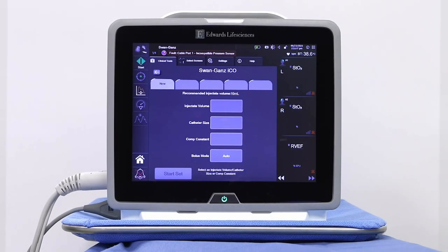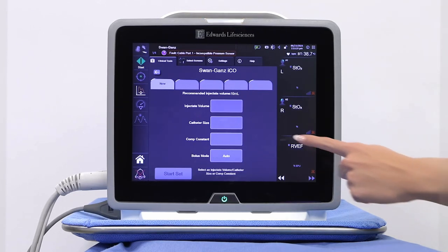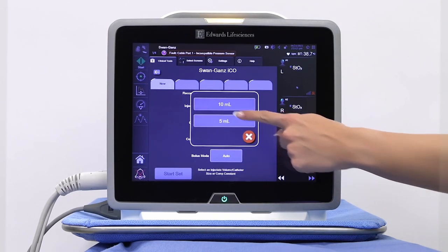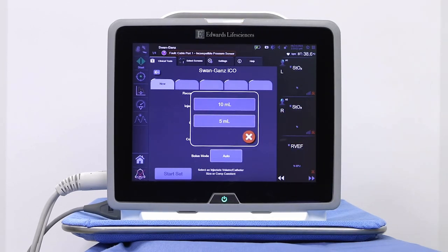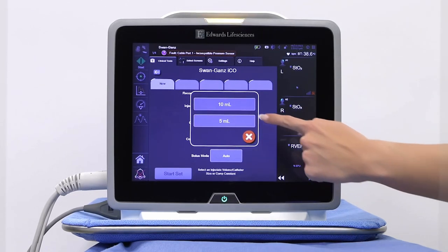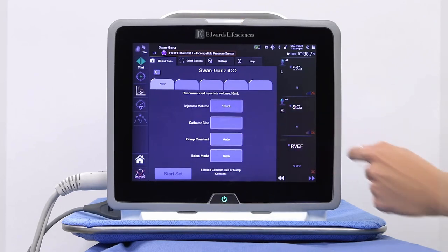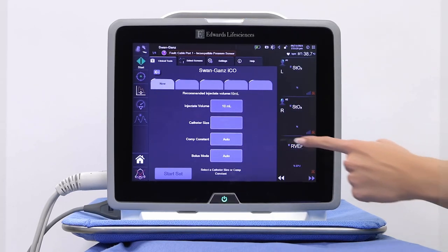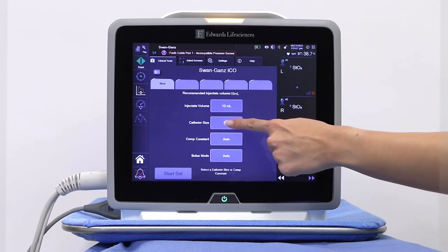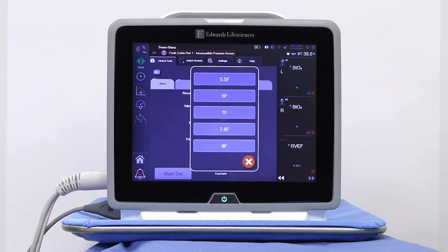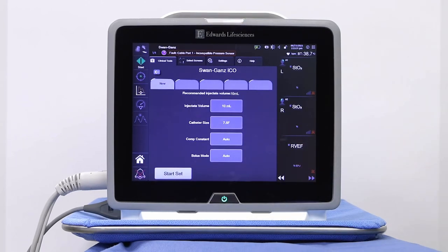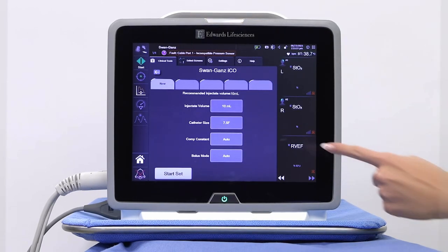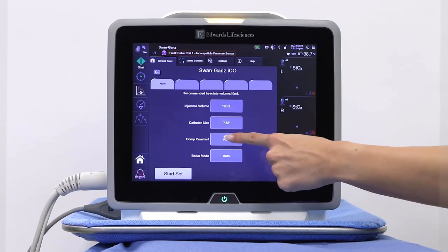Specify the desired injectate volume from the list of values provided. Once a value is selected, the computation constant is automatically set. Select a catheter size from the available list. Choosing a value here also sets the computation constant.